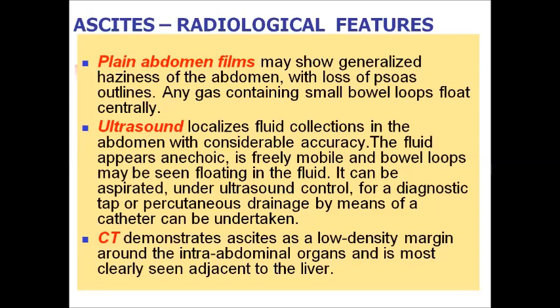Under ultrasound control, ascites or abdominal effusion can be aspirated for diagnostic purposes, and drainage by means of a catheter can also be undertaken.